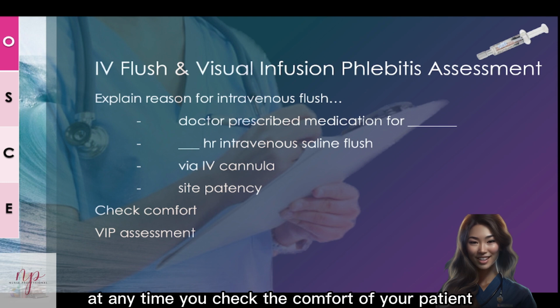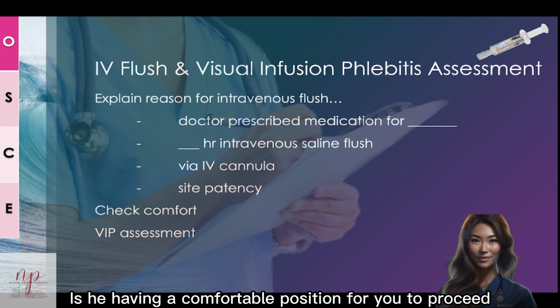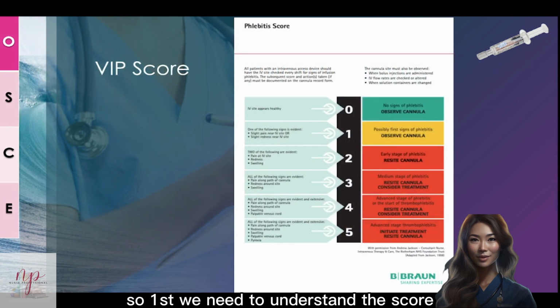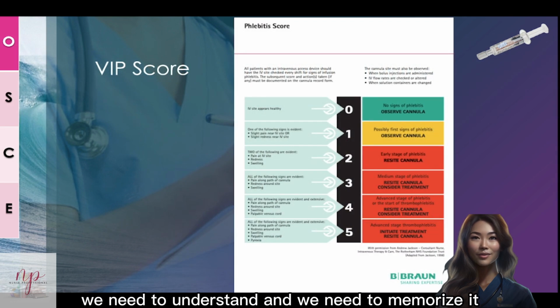At any time, you check the comfort of your patients, that they are in a comfortable position for you to proceed. And then you go ahead to do the VIP assessment. So first, we need to understand the VIP score. We need to understand it and we need to memorize it.